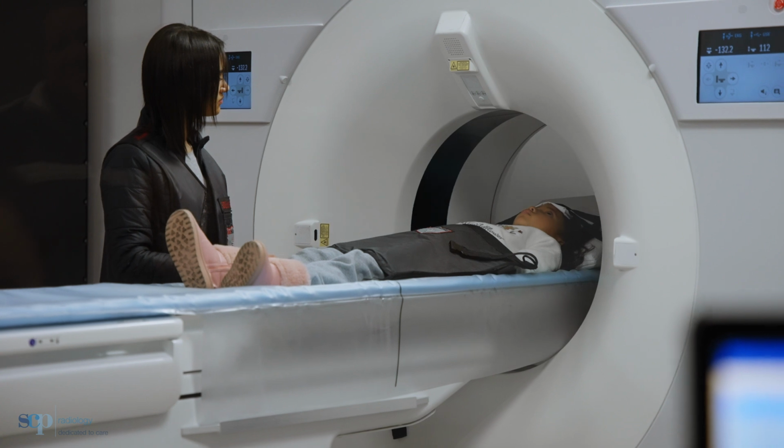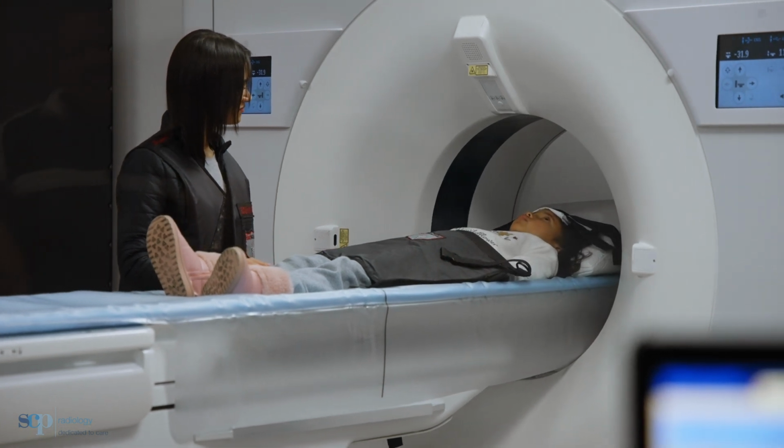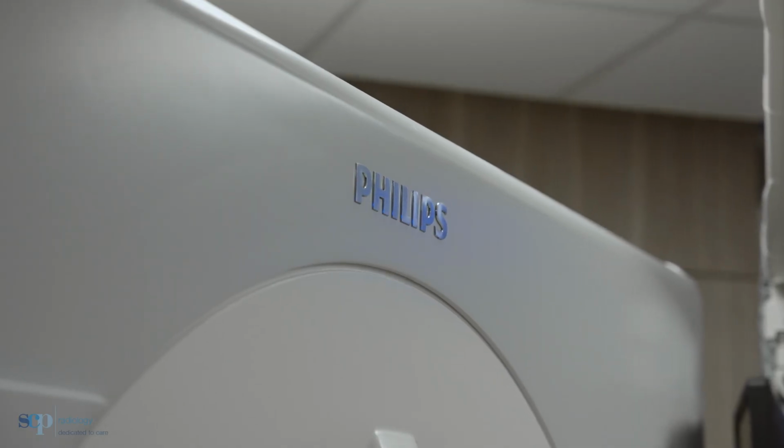Another thing that we want to exclude is a fracture of the skull or fractures of the facial bones. It is extremely important to timeously diagnose hemorrhages within the brain, on the surface of the brain, or skull fractures that might need surgical intervention. You want the surgical intervention to be as soon as possible after the traumatic injury. So in that case, it's extremely important to have a CT scan and be able to make that diagnosis.